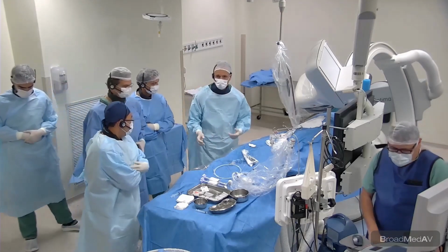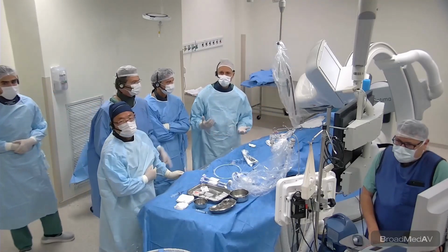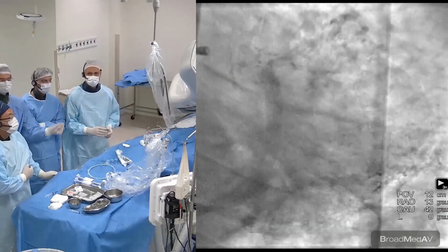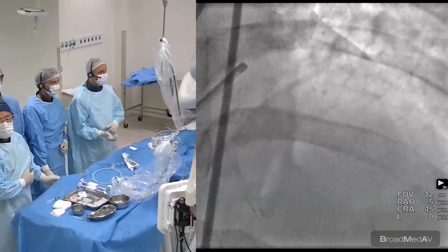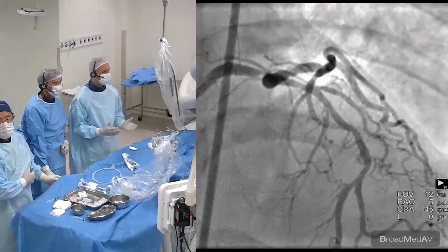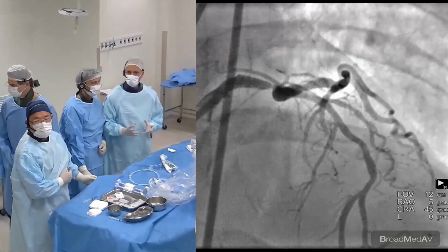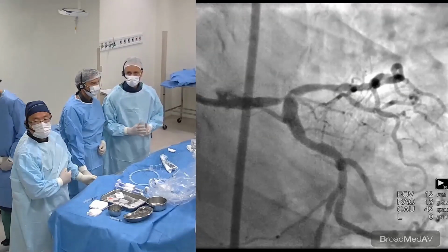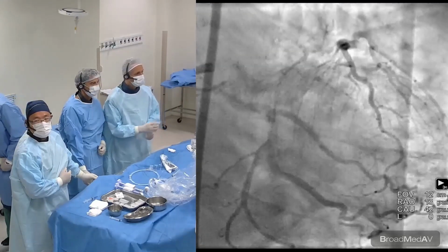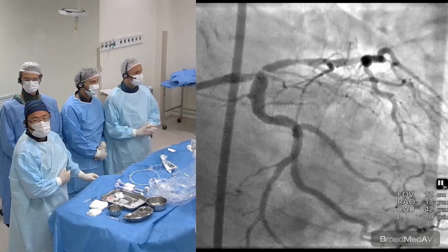Basically, this patient, we are using 7 French, doing femoral. Yesterday she had a diagnostic. Can you see the image now, please? Yesterday we did a diagnostic cath by radial, but it was not a very large radial, so that's why we decided to go femoral and 7 French. Always when you deal with a bifurcation, even though you're not going to do elective double stenting, we like to do 7 French. So here we see the RAO view, and a very, very tight stenosis.